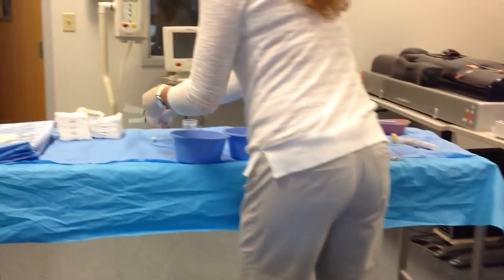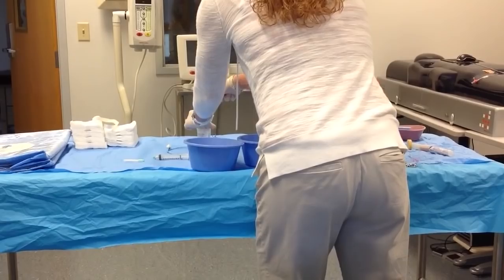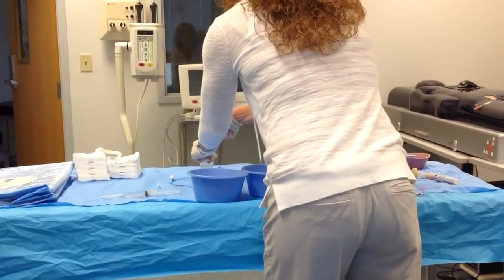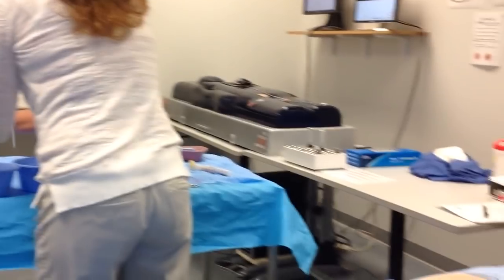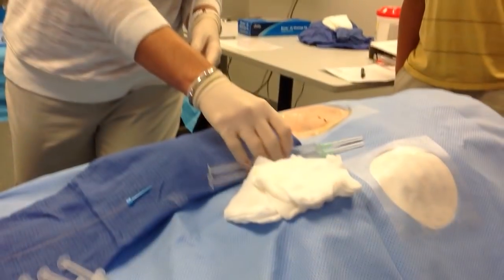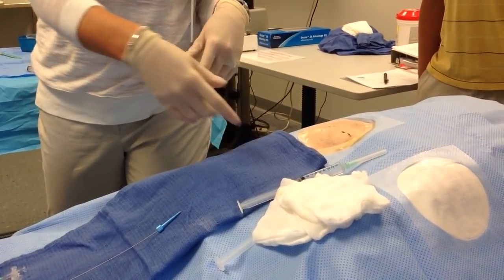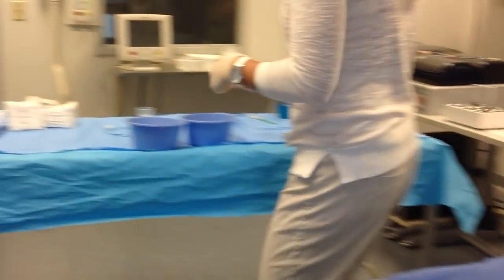We'll bring our lidocaine over. I'm going to fill these up all the way so they can aspirate back a little bit to make sure that they're not in the artery or in the vein. You don't want to inject this right into the artery or vein. So this is the lidocaine. These are typically marked with stickers, because you have the needles on, and they have red plungers because you don't want to get them mixed up with flush, obviously.